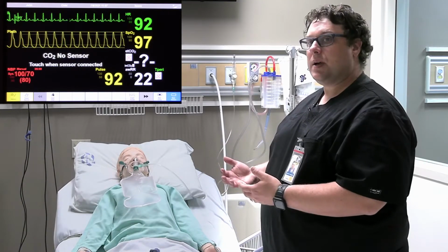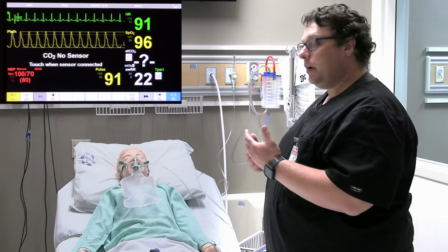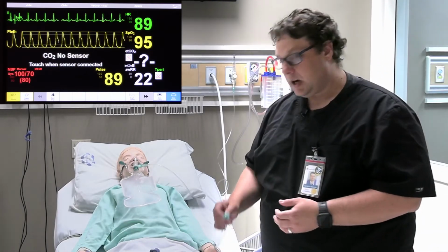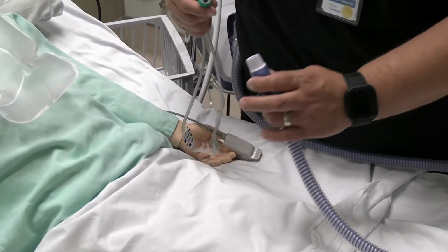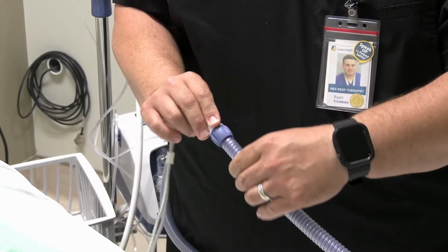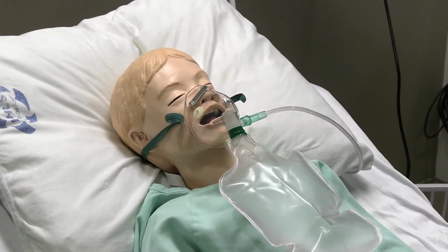So the next best course of therapy is high flow oxygen therapy. We've already run through the setup of the device. Now we've selected our nasal prongs. So we've selected the extra large nasal prongs for this patient. We're just again going to attach the nasal prongs to our patient circuit. We're going to remove the non-rebreather from the patient.